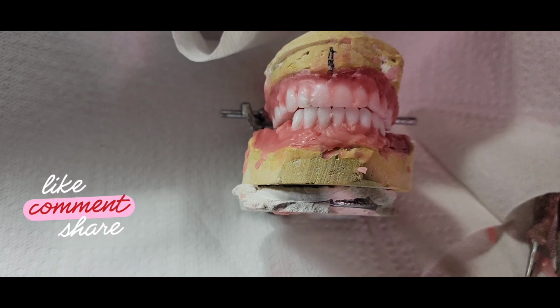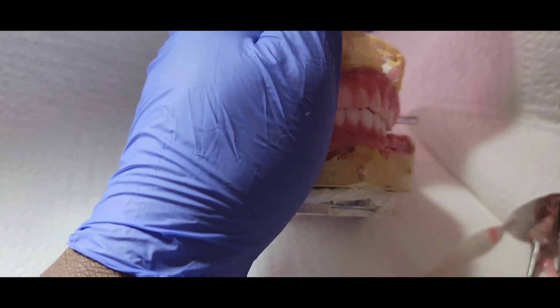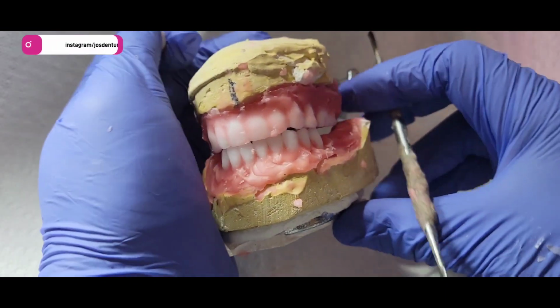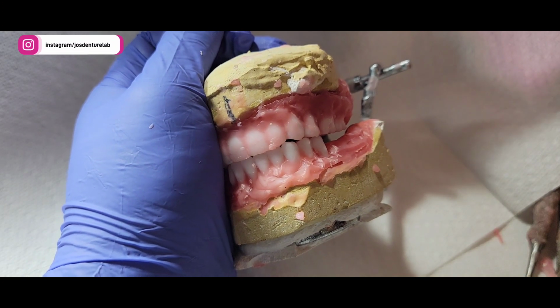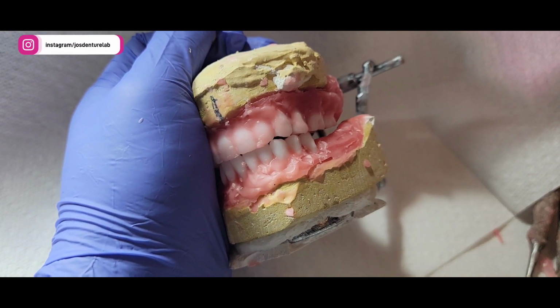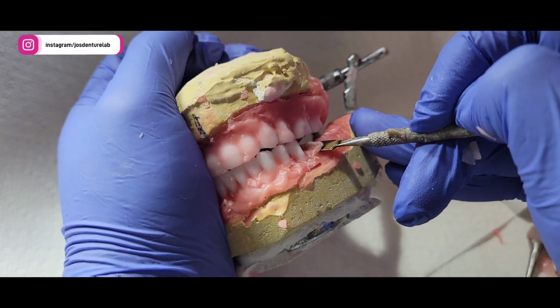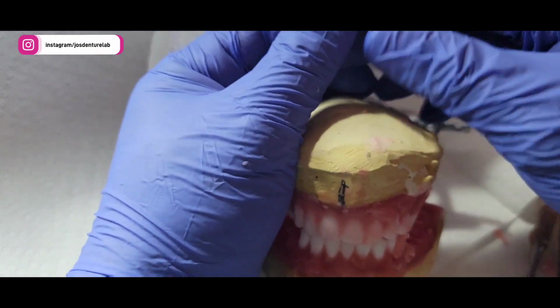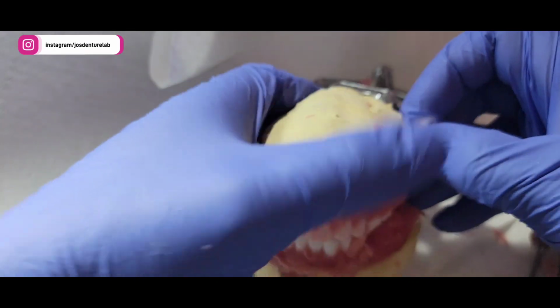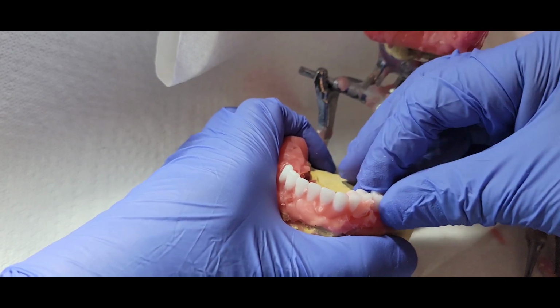Hi, welcome to this episode, part two video. I already put the first anterior teeth on. I'm going to do the other posteriors. As you can see, I'm carving around, so then I can place that tooth on location.